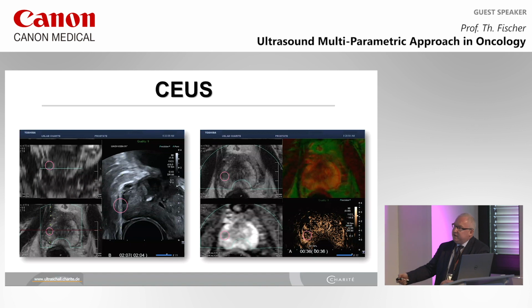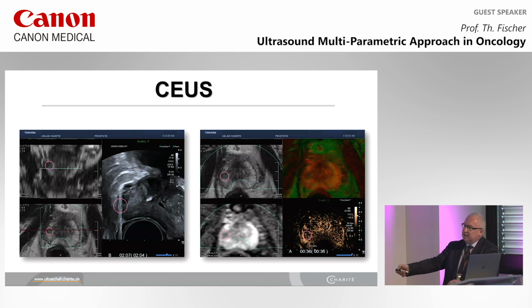So that means everything is possible. And by the way, we can recreate different scan planes: coronal, sagittal, axial, also the puncture procedure. And that works not only for prostate, that works, of course, for liver lesions, for everything, for picking up our tumors. But prostate is once again a very small organ. And I can say, as an interventional radiologist, if this works on prostate, it works definitely on liver.